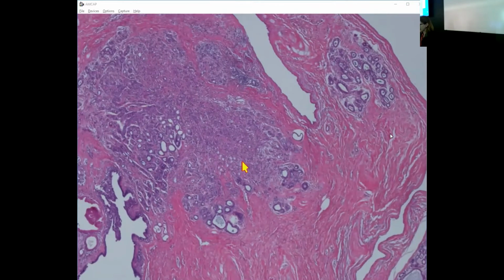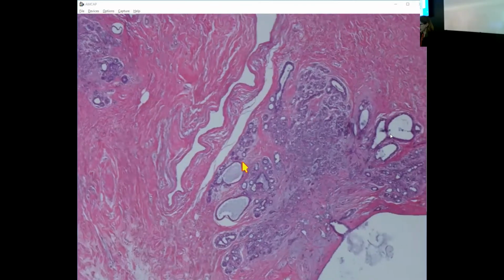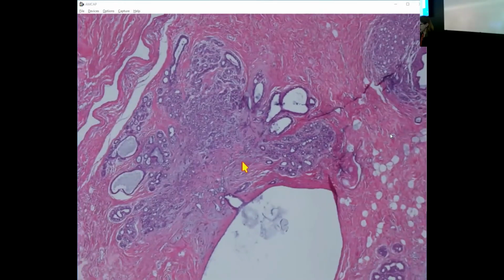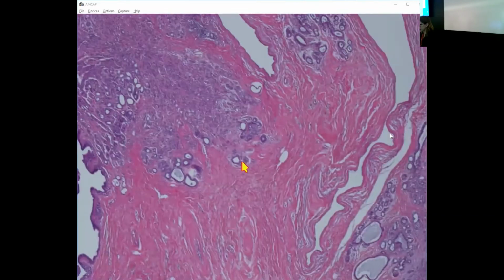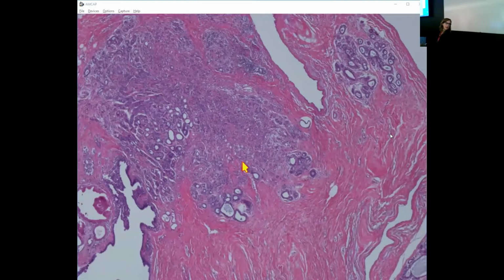Wow. Okay, I will say only my first impression. Maybe I'm wrong, but there is something that reminds me. There are a lot of little glandular, like an adenosis.